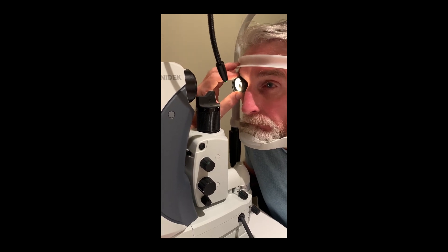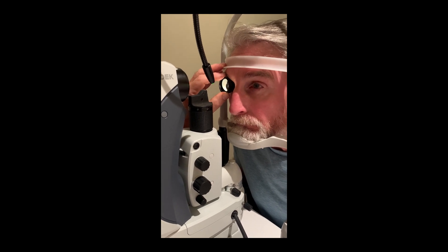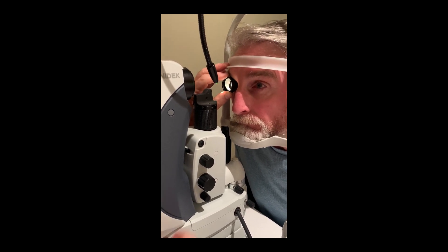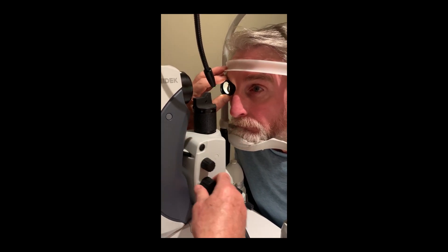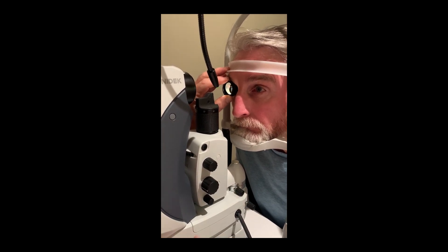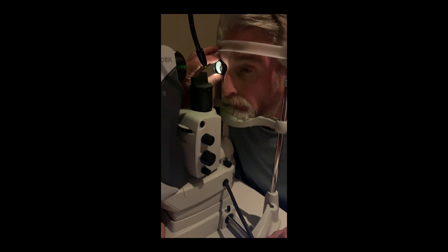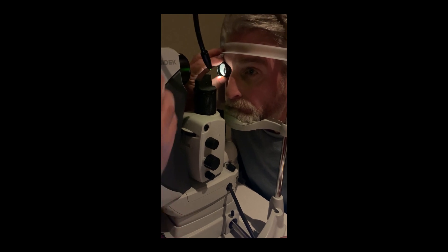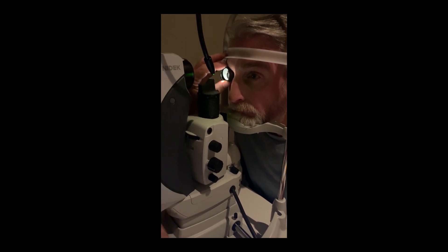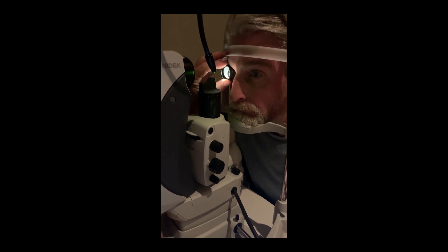If I'm using a laser, I want easy fingertip control. I'd like to be as precise as possible and have it be functional. If I'm treating a patient's right eye, I'd like the control panel shifted to my right, and if I'm treating a left eye, I want to shift it to the left — I'd like that mobility.